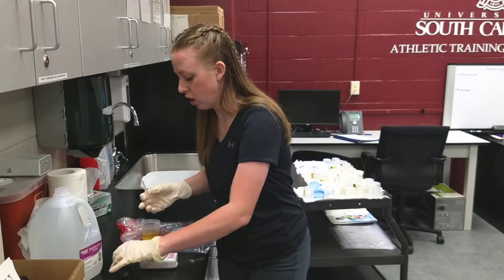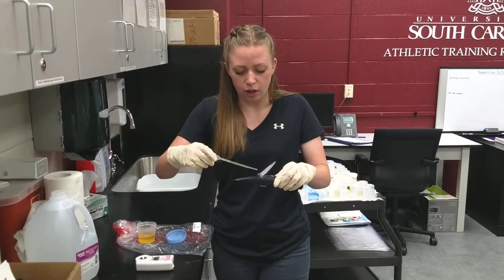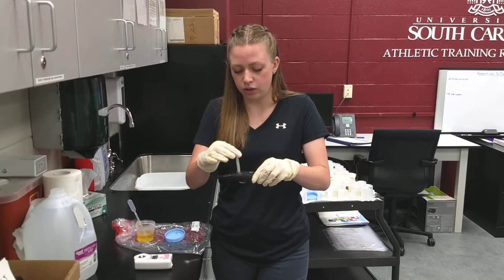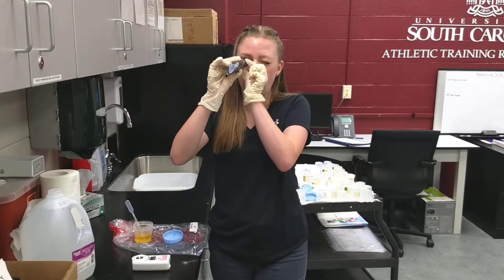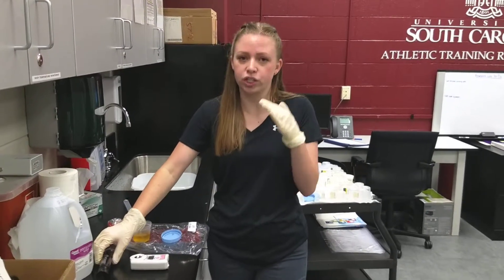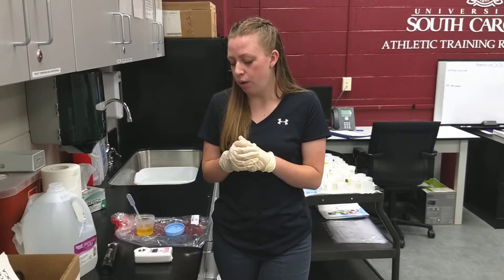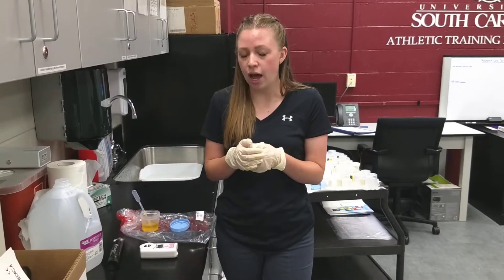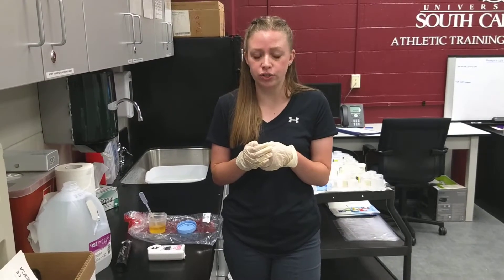For the manual refractometer you'll place a couple drops onto the panel and close the plastic covering. You'll then look through the eyepiece and you'll see a line where the color changes from blue to white. You want to use a scale that starts with 1.0. This patient has a specific gravity of 1.027.